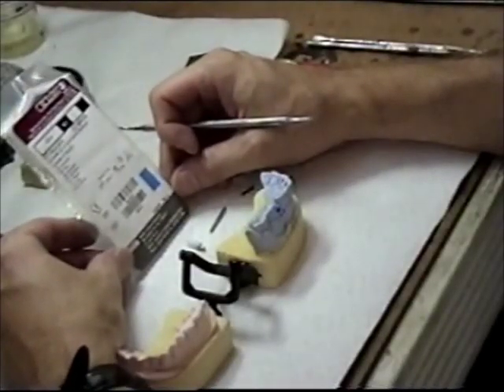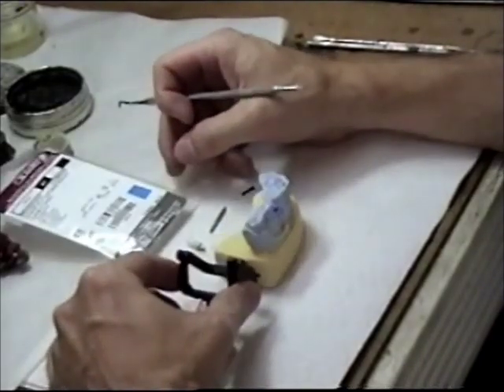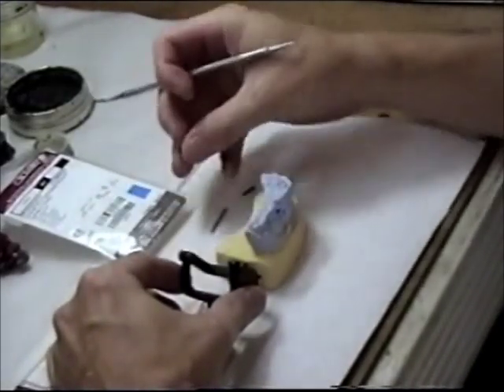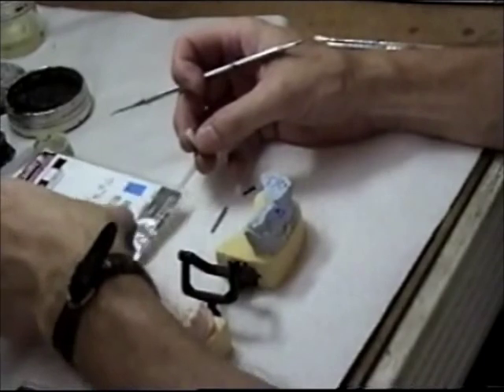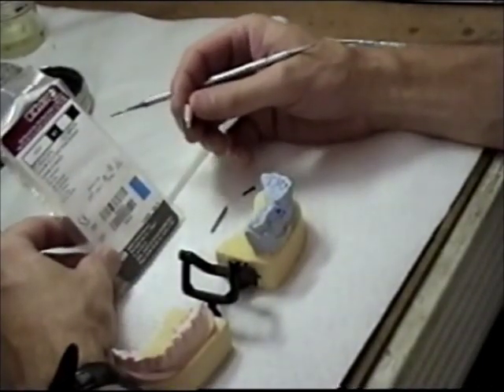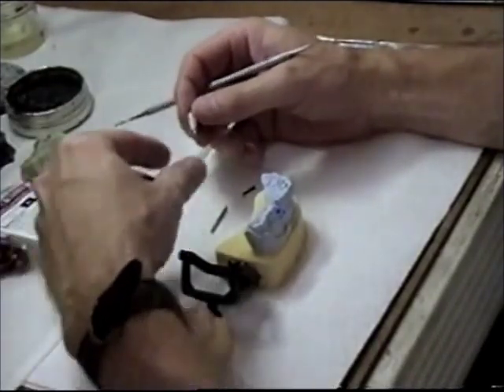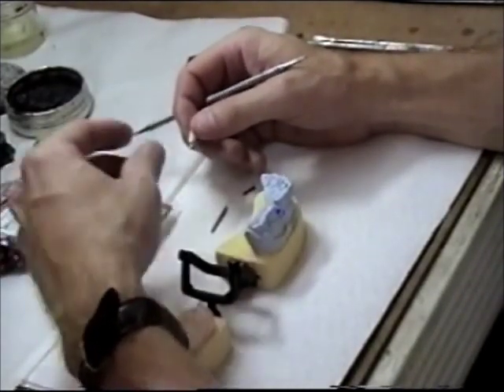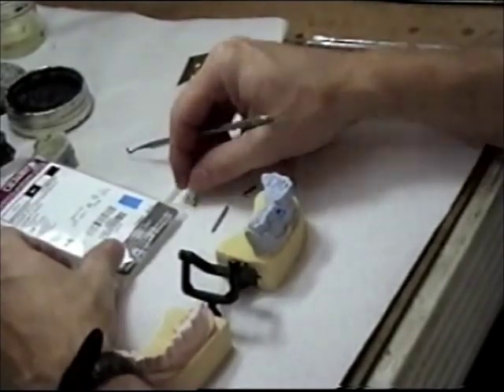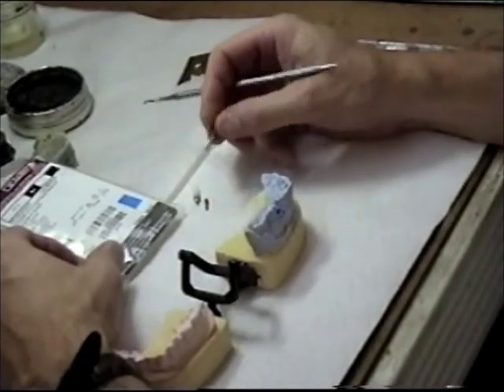A cement retained implant crown. I have my model here. I have the 4.1 gold hex abutment — it's a plastic cylinder with a gold base. I have the lab screw and I have a wrench.